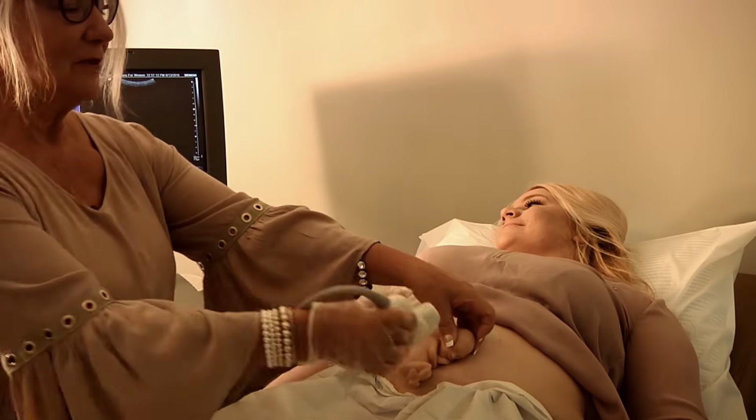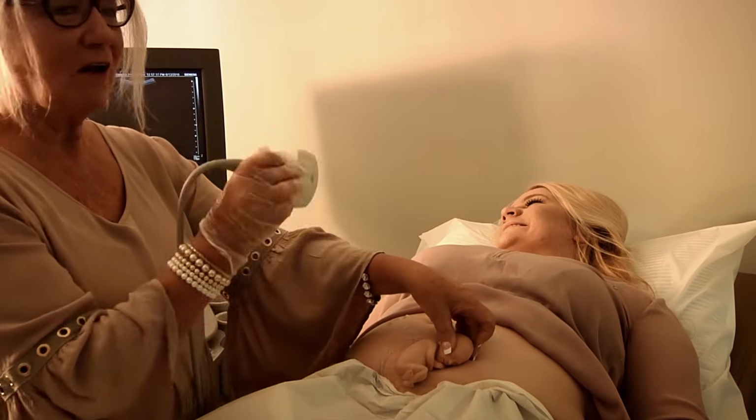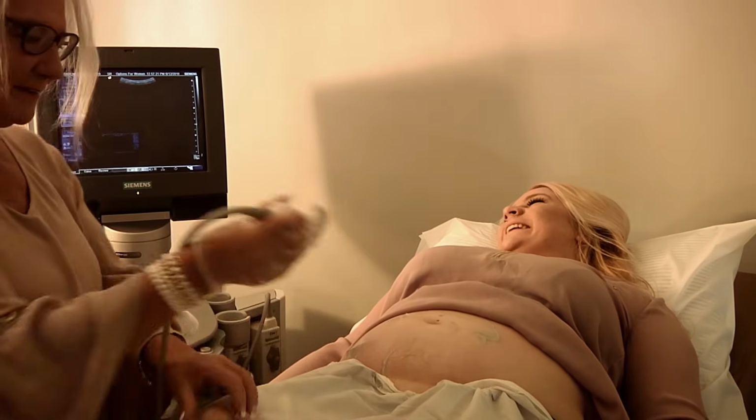All right, so we got our lie of the baby. We forget about mom. We're done with mom. It's all about baby now. Okay, sorry, mom. That's just the way it is.